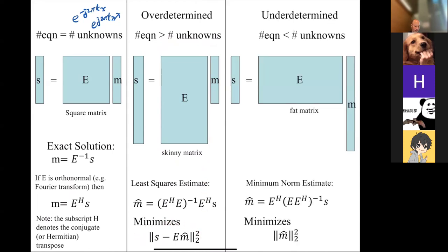Okay. And what we want to talk about today is to review what happens in the underdetermined case. All right. So now you see this output vector here is a smaller length than the input vector. Okay, so that means if I had a 256 by 256 image, maybe I only acquire half the k-space lines, so I don't have as much data. This matrix gets smaller, and now, as you know from linear algebra, I have fewer equations than unknowns.